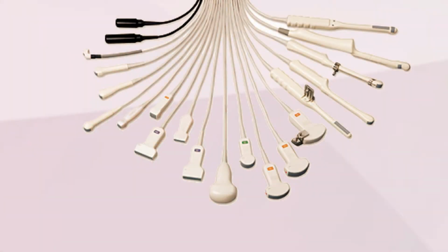Ultrasound technology is rapidly advancing and being refined and is aimed at both increasing image quality and opening new fields of applications. So what equipment do we need for MSU? First of all, we need a transducer. Transducers come in various shapes and dimensions and are designed for the body parts they have to assess. For MSU, we generally use the straight linear transducer.